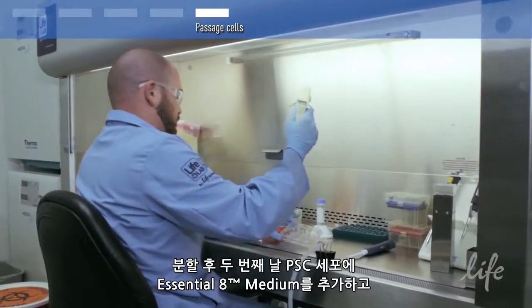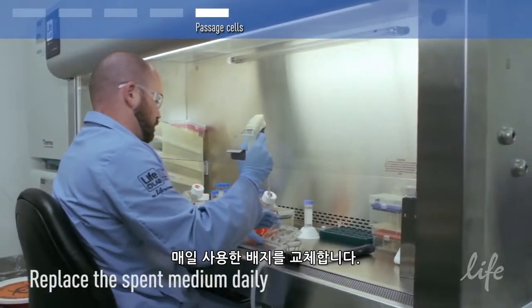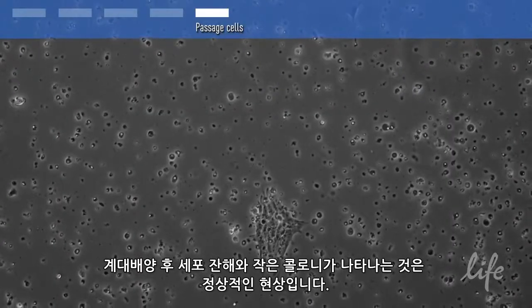Feed the PSCs with Essential 8 medium beginning the second day after splitting and replace the spent medium daily. It is normal to see cell debris and small colonies after passage.